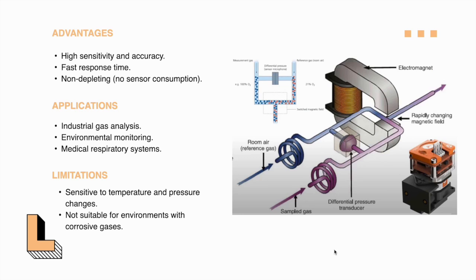The limitations of using this type of analyzer are that it is highly sensitive to temperature and pressure changes and that it is not suitable for environments with corrosive gases.